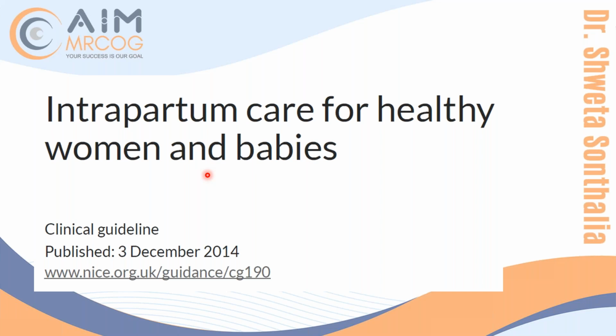Sometimes it's very confusing. Sometimes even after understanding everything, some CTGs are funny to understand. That's the fact. But in the exam, they give you a clear-cut CTG where you can make a plan: clear-cut pathological, clear-cut normal, or suspicious, where you have to continue monitoring the baby. So these are the three categories of CTG. We'll go step by step from the basics till reading and applying on the question, so you get clarity about how to apply it in the exam.